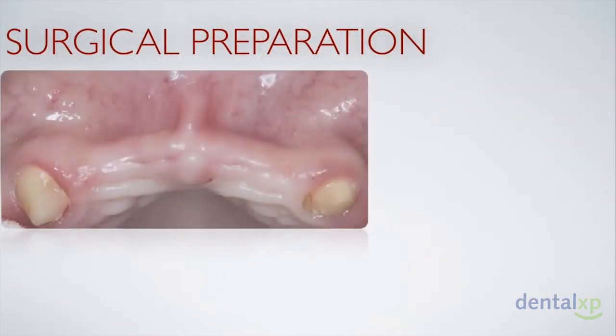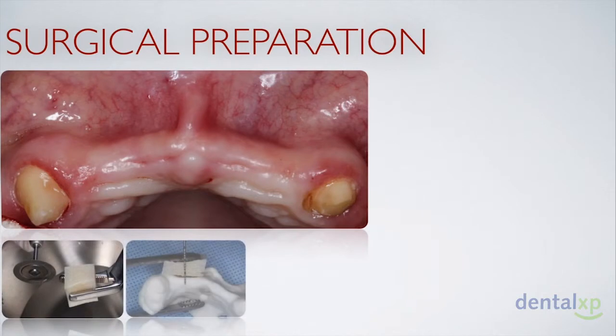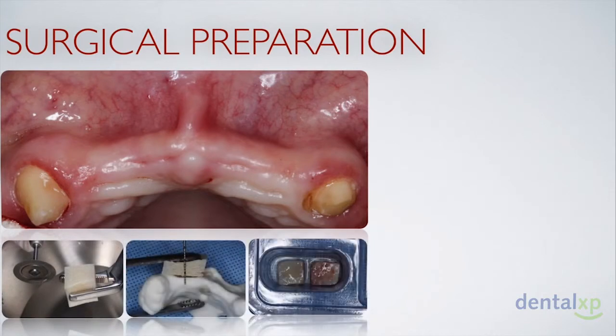So we proceeded with the surgical preparation of the case, and as you can see, the block we chose here is an iliac crest bicortical allogenic block with a cancellous portion between the two cortical plates. The blocks were contoured and adapted to the models we had beforehand, prior to even accessing the site, and this really reduces the surgical time needed for the procedure.